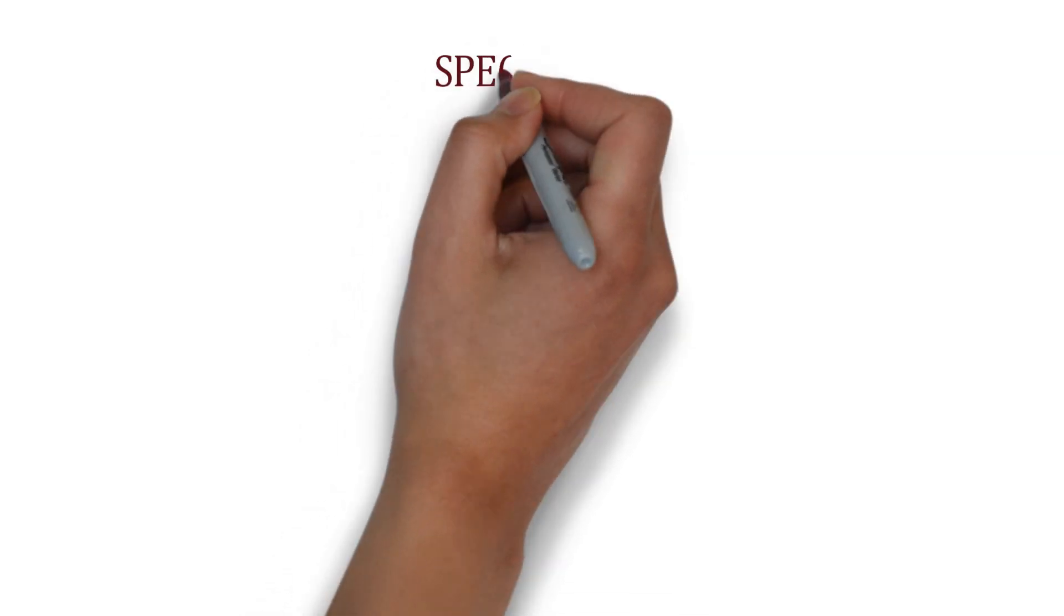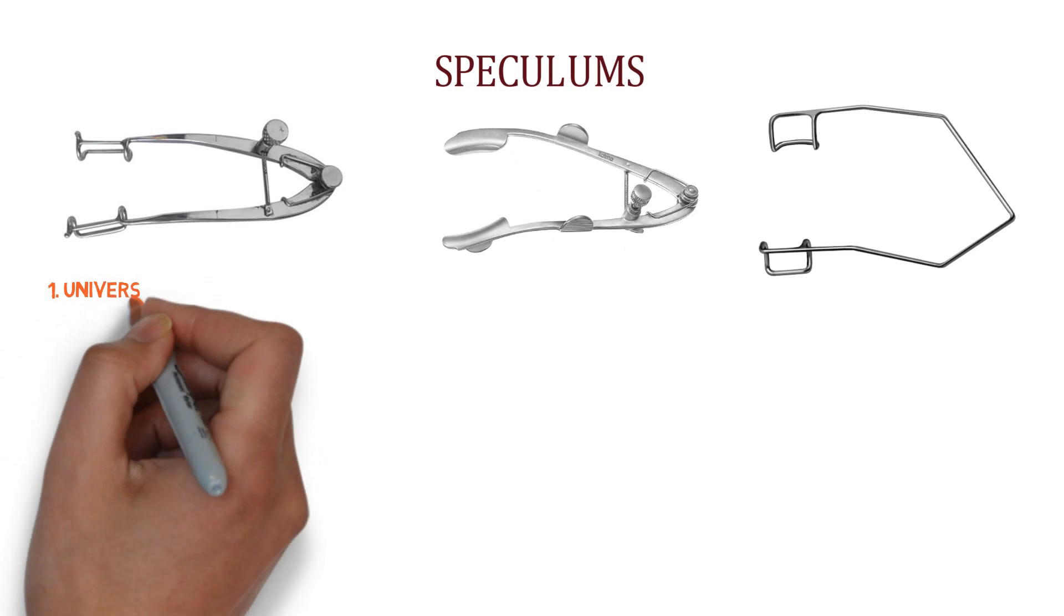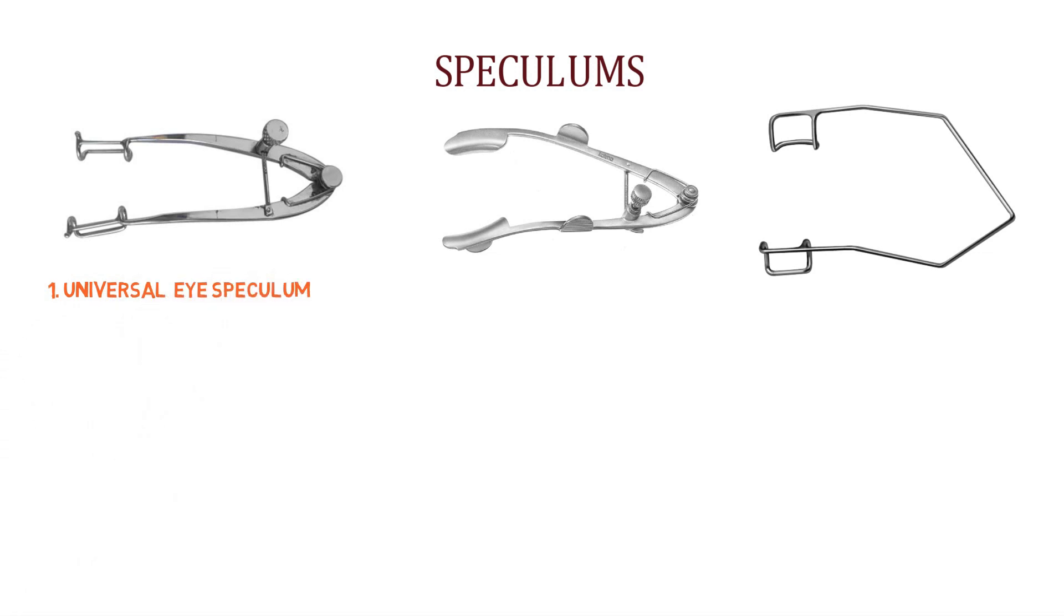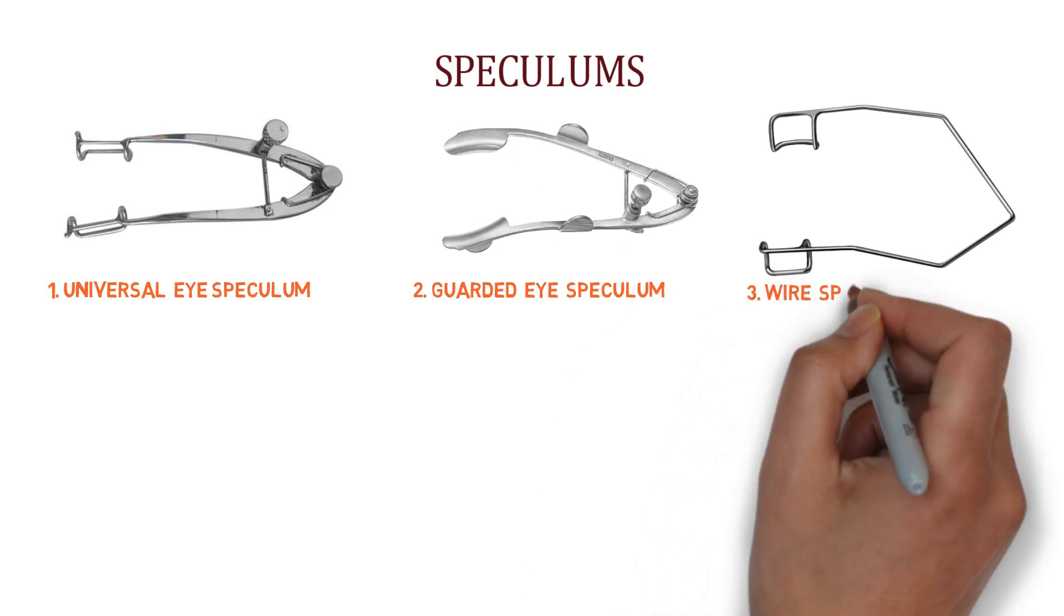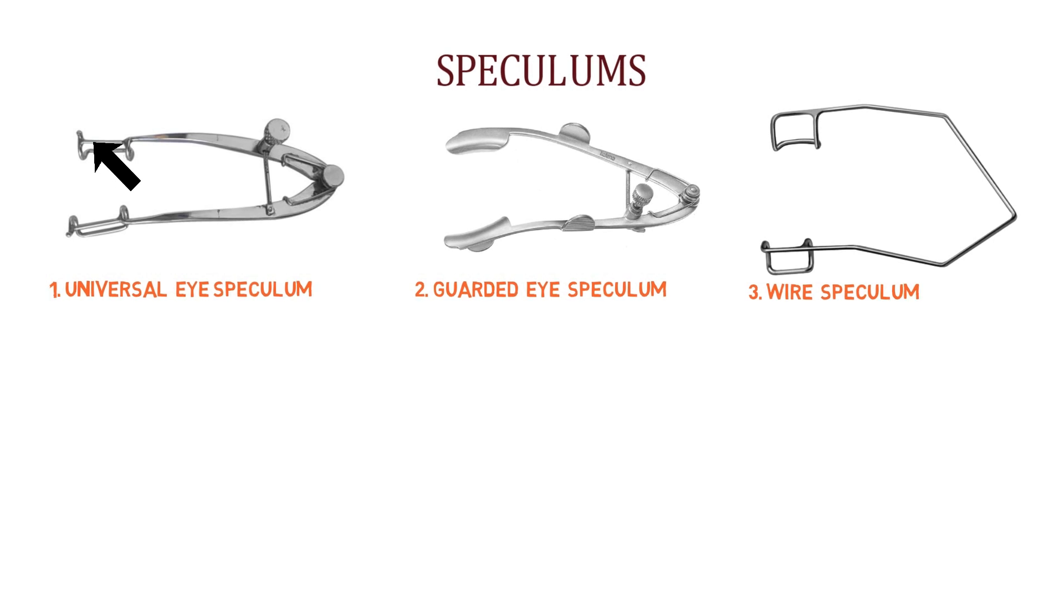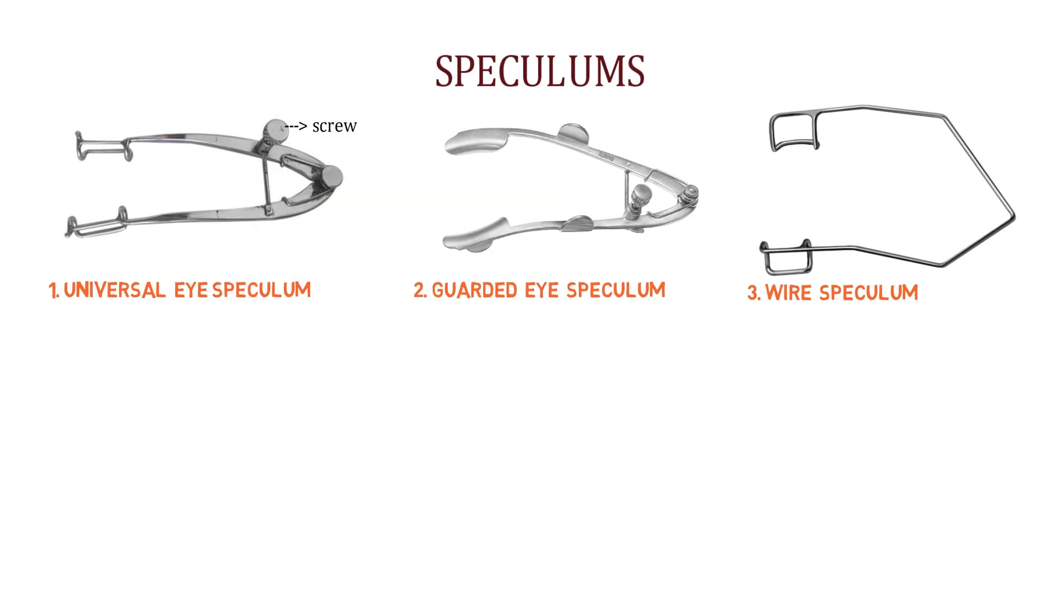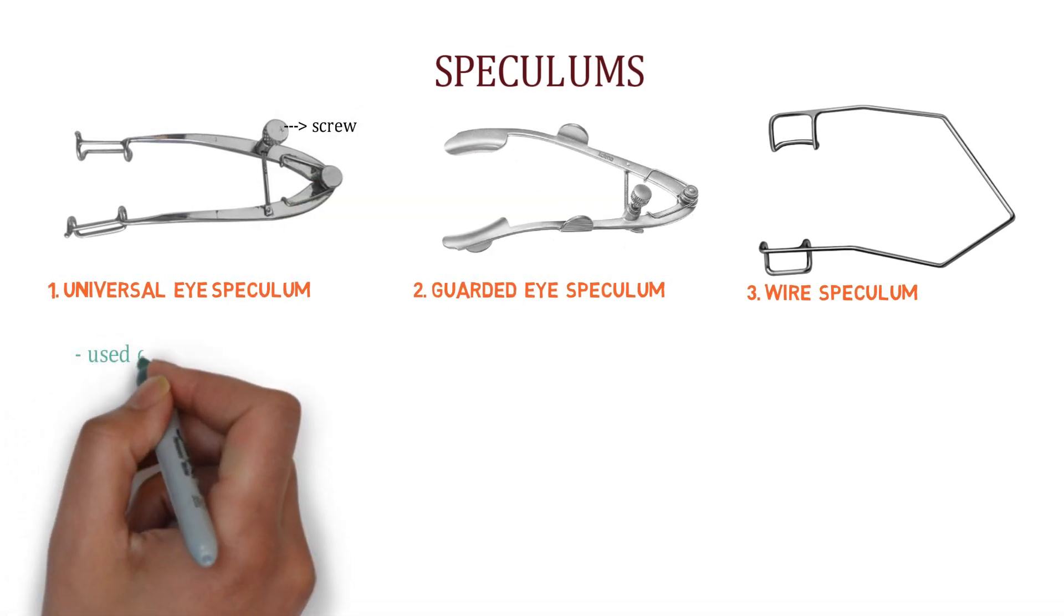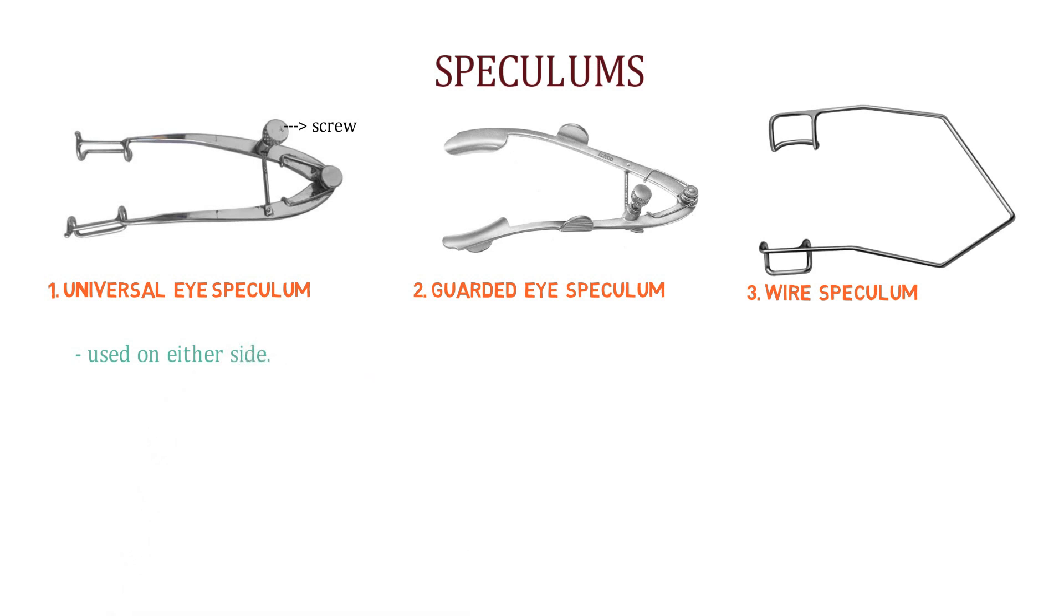Let's talk about the eye speculum. So we have three types of speculums. First one, this is second one and this is third one. So this is universal eye speculum. This is guarded eye speculum and this is wire speculum. How can we identify this speculum? Look over here. It has a spring and two limbs and a screw to adjust the limbs. And it is called universal eye speculum because it can be used on either sides. This means it can be used on left eye or right eye.